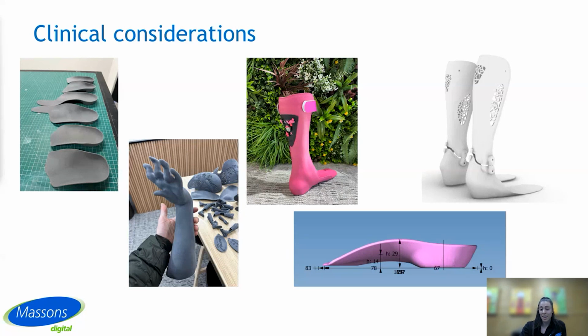Finally, communication is key. The communication with your client as to how a 3D printed device differs to a traditionally made device, what their expectations will be. Communications with the digital manufacturing team, if you're getting it CFAB'd, are so important to make sure that what you're wanting from your device is what you're getting back. And finally, feedback through all those communication channels mean that not only will your device exceed expectations the first time you do it, the next one will be even better.